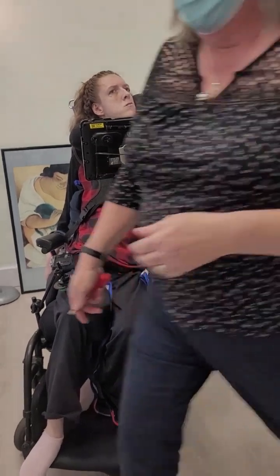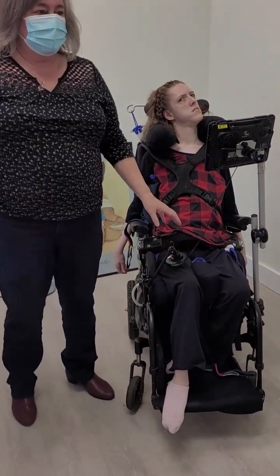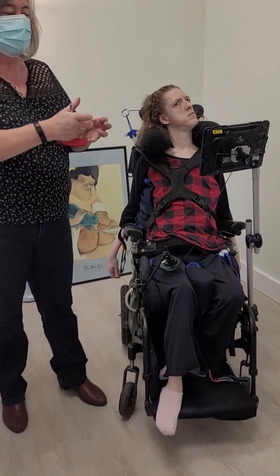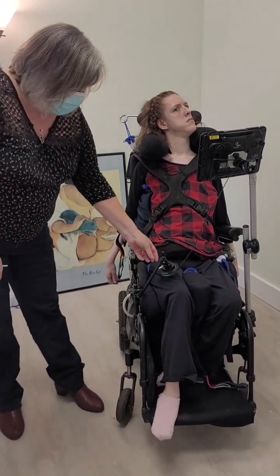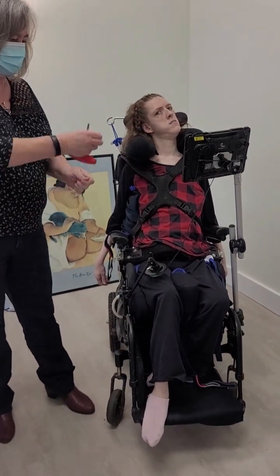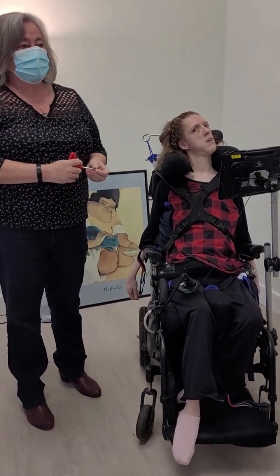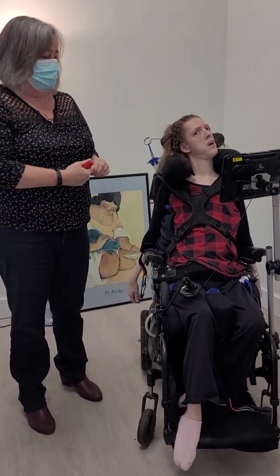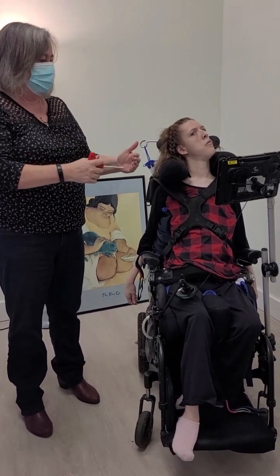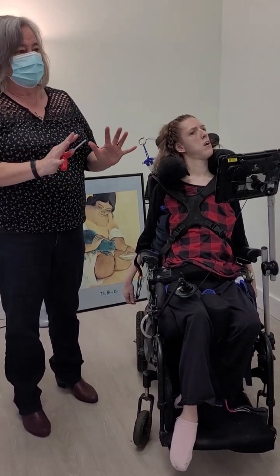The other thing that might be a problem is if this has loosened off. Sometimes the switch itself gets a loose lid and you just have to tighten it manually with your hand. If the switch is not working properly and you've tried taking it out and putting it back in, and you've run your fingers along to make sure there aren't any kinks, then it's time to talk about a new switch — reach out to Sam or directly to Kaya. It's not foolproof. Sometimes you just plug it back in again or take it out and it'll work, so don't give up right away.